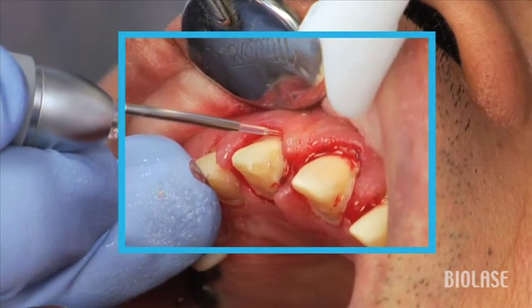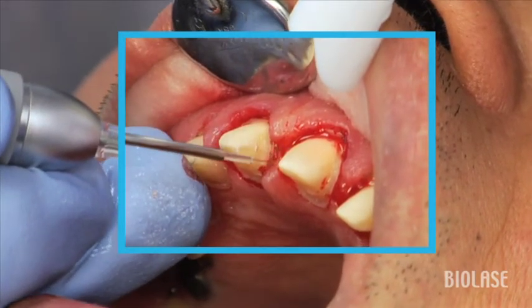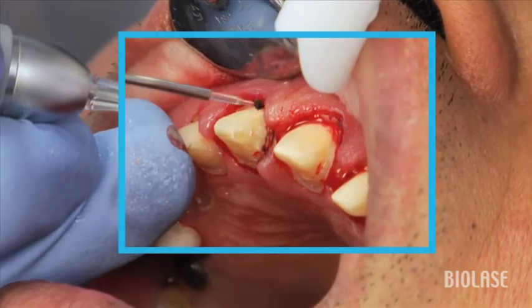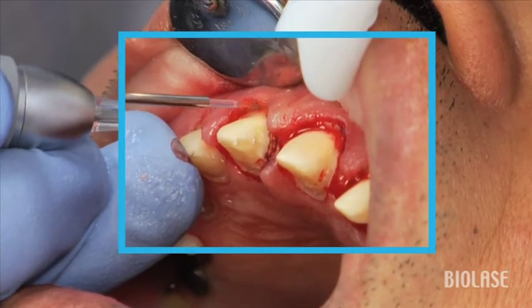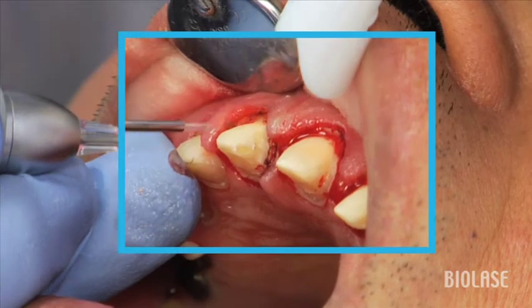When troughing with the diode laser in lieu of packing cord, there are three important things to keep in mind. Number one: use short overlapping strokes, maybe two millimeters, and overlap. This allows the laser energy to adequately infuse into the tissue and remove tissue without actually doing a surgical type procedure.